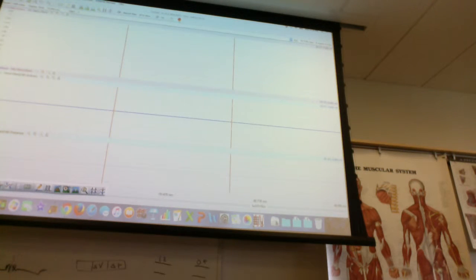And the first thing we need to do is you'll notice on this chart here that we're going to have stuff that says anterior and posterior. And there's one of these windows that closed down so you can't quite see it. Which of those muscles is anterior, the bicep or the tricep? Guys, what's the anatomical pose? I heard a lot of people say tricep, it is supposed to be bicep, okay? So anterior and posterior EMGs.